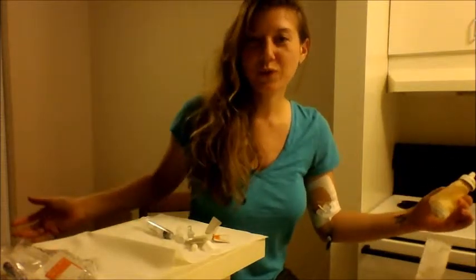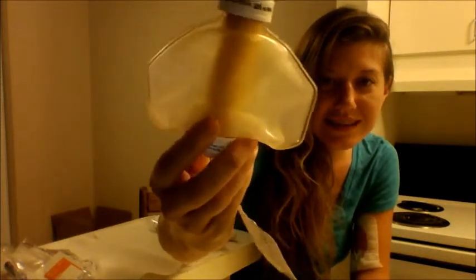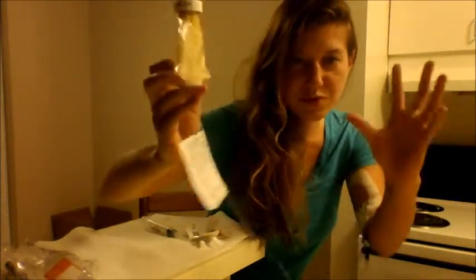Hi guys, and welcome back to part 2 of Infusing. This is what your pump will look like when it's empty, completely done. It looks like an insect as opposed to a Christmas ball.